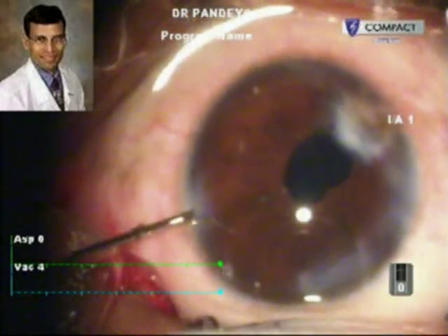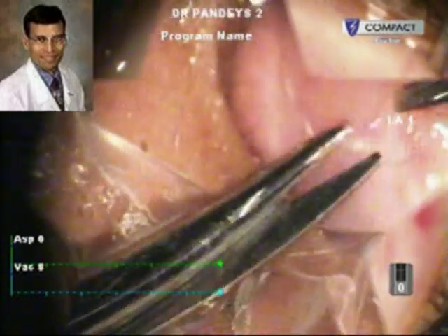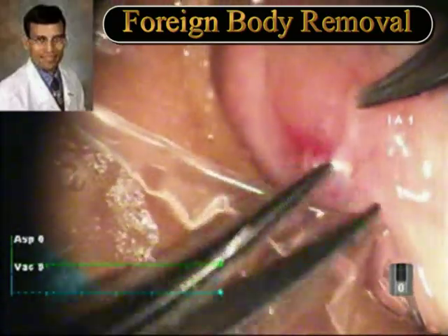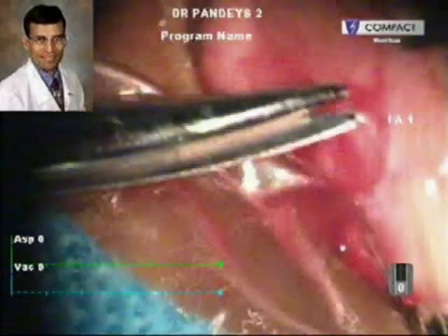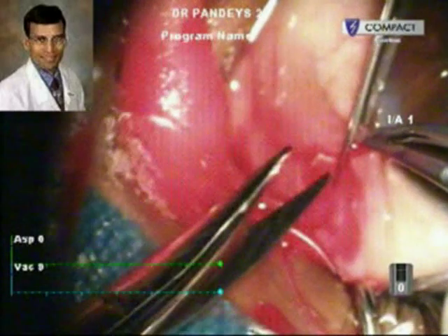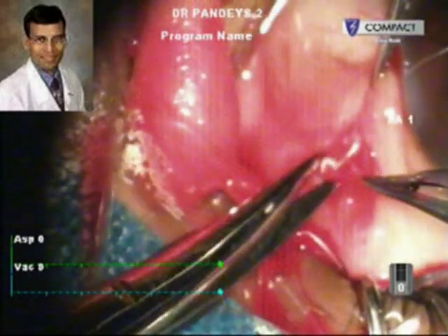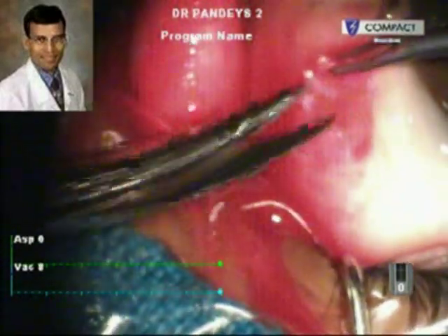At the end, we injected intracameral moxifloxacin — intracameral Vigamox. Now here you can see a sub-conjunctival foreign body is being removed. In this particular case it was a non-radiopaque aluminum foreign body which had come from the material used to initiate the blast in the mining. The conjunctiva is being dissected to reach the foreign body.